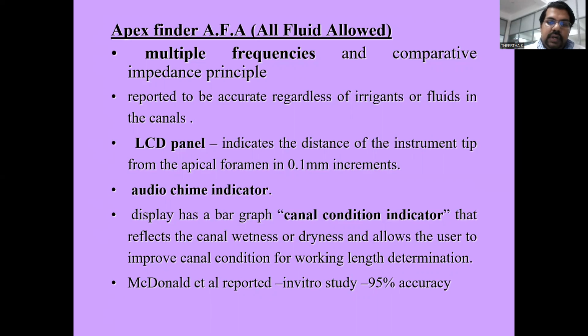McDonald et al. reported an in vitro study where he said that the Apex Finder AFA, all fluid allowed, has 95% accuracy.